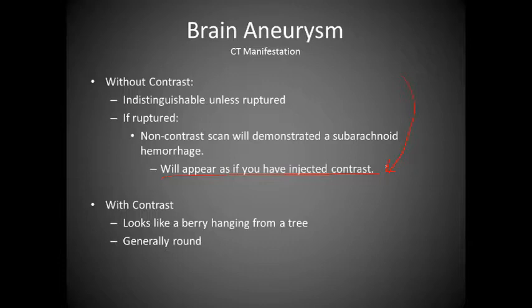They bring her out to the ER, and we take her in the scanner. As we have her on the scanner, she's getting sick, and we're having difficulty making it through the scan. We finally make it through, and the other tech and I just look at each other, because it looks like we've injected contrast all through her brain, but we've not injected anything.